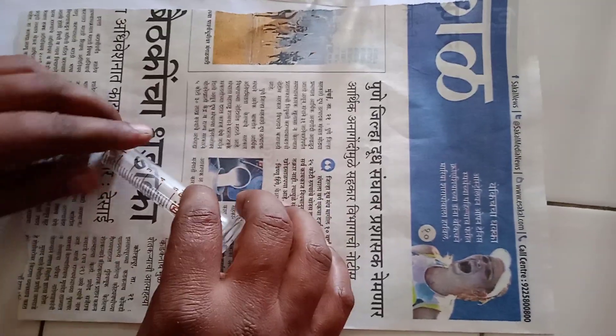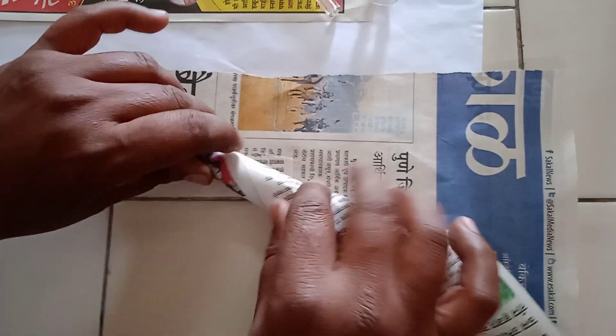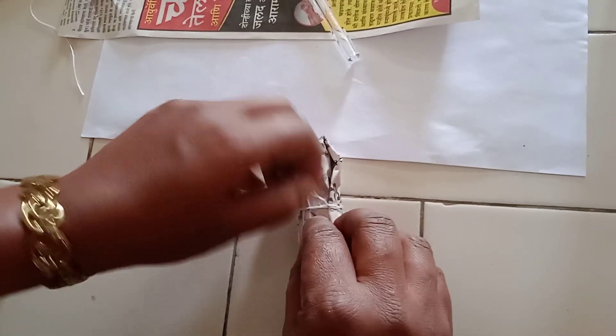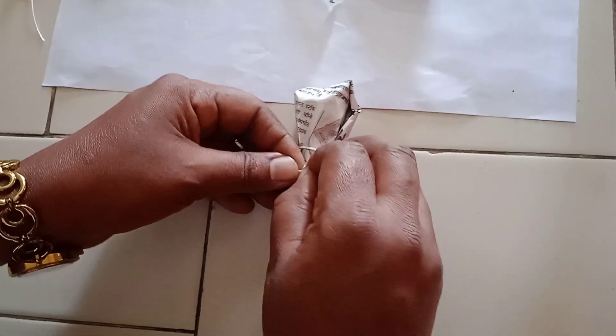Now I will show you how to wrap the syringe. You have to separately wrap the barrel and the plunger of the syringe. After wrapping, you have to tie it with thread like this, so that the wrapping paper will not come out from the syringe.